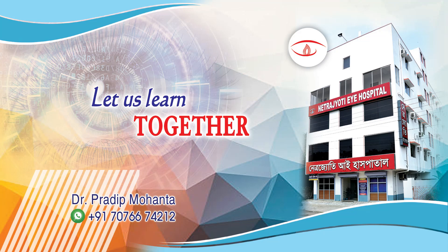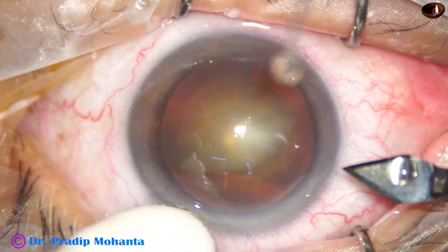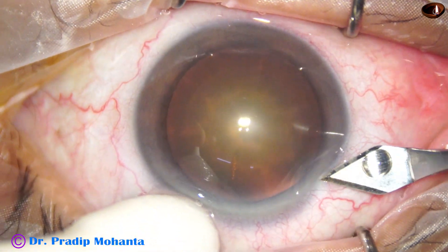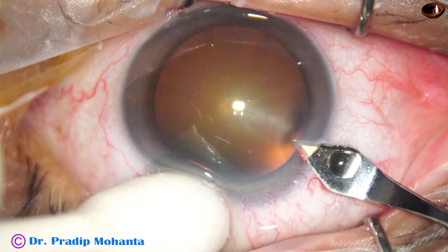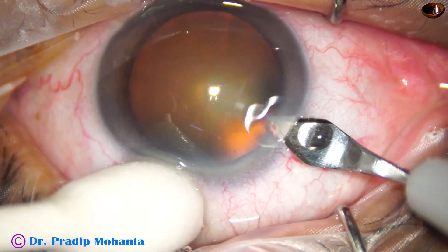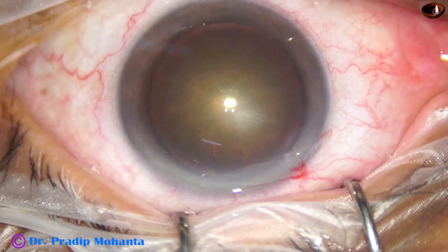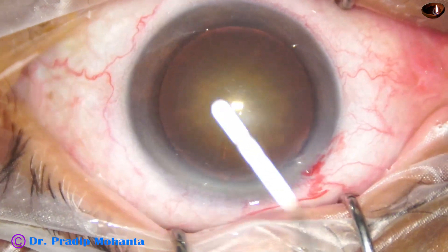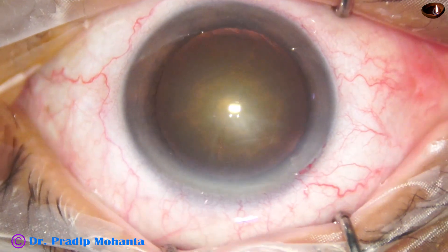In this video we are going to see management of a posterior subcapsular cataract with grade 2 nuclear sclerosis. This is the main incision with a 2.8 millimeter steel keratome. The patient is under topical anesthesia.